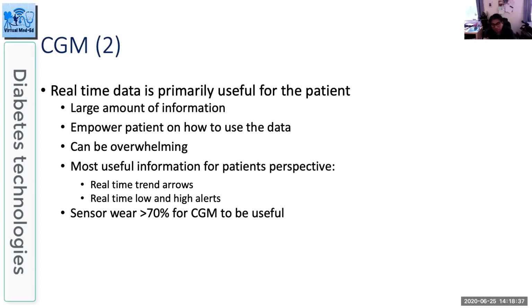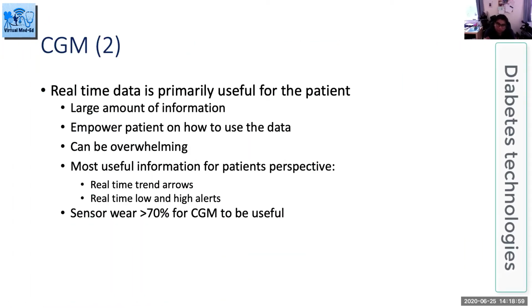However, there's a huge amount of information, so you really need to empower the patient on how best to use the data in a practical sense. And always be mindful, because too much data can be very overwhelming. You may put them off, and it's an expensive tool. So it's worthwhile spending a bit of time from the outset on what kind of data they should be looking at.